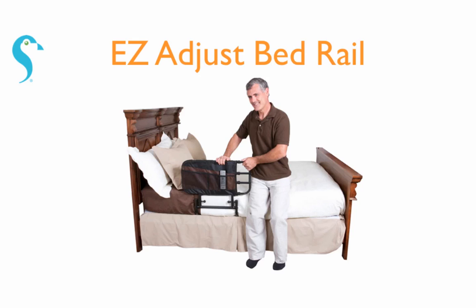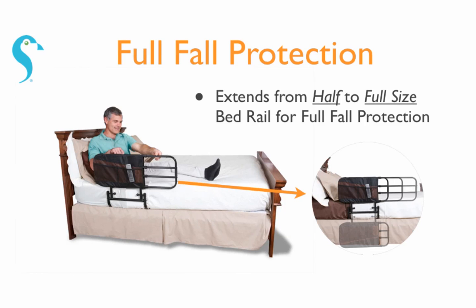The Easy Adjust Bedrail from Stander attaches to any home or hospital bed by sliding between the mattress and box spring, and is secured with the included safety strap. It's the only bedrail on the market that can extend from a half-sized bedrail to a full-length bedrail for fall prevention after it's installed on the bed.